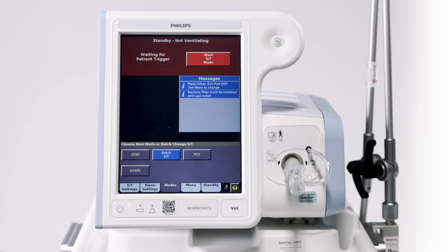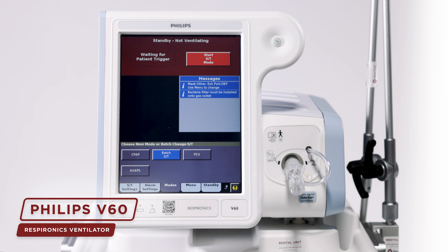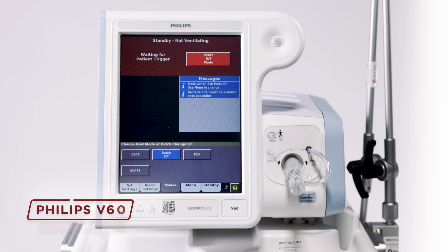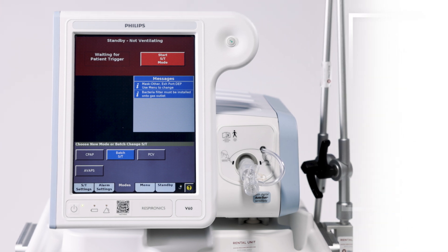Hi, my name is Garrett. I'm the biomed manager for MedOne. Today we're going to cover the V60 ventilator. We're going to go over some of the modalities and program and set up for patient use.